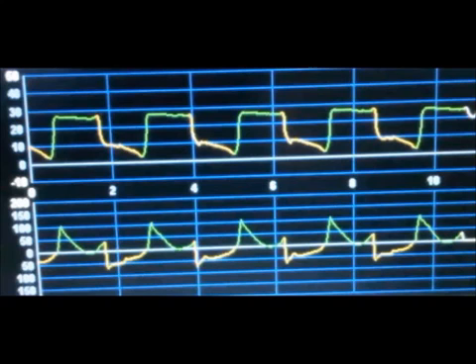Since we are using pressure control now, my most diagnostic waveform is going to be my flow waveform, and that's the second, or the bottom, waveform here. And we want to look at this waveform for diagnostic purposes. Now, in previous videos, I mentioned that if you're using pressure control ventilation, the patient should be able to get all the flow they want. And flow is kind of independent of the pressure control setting.